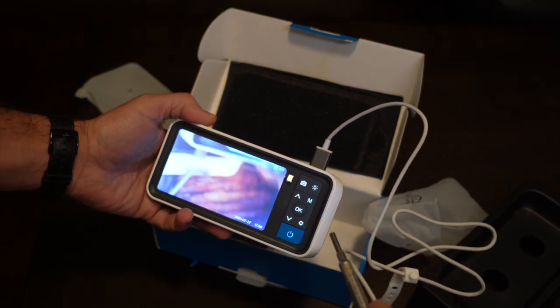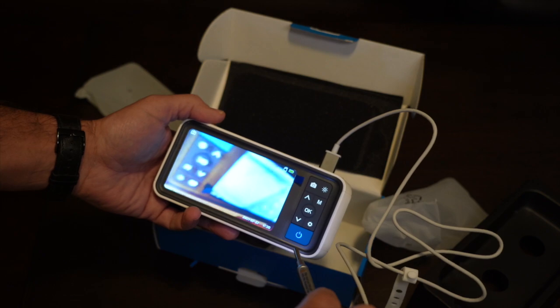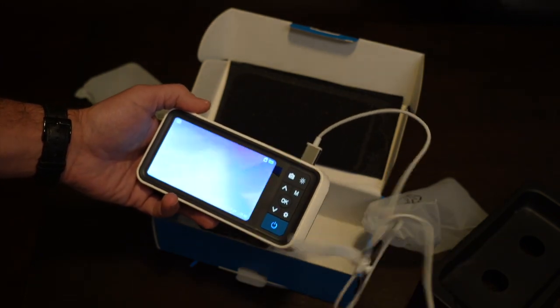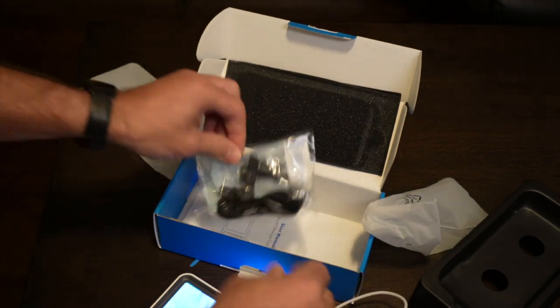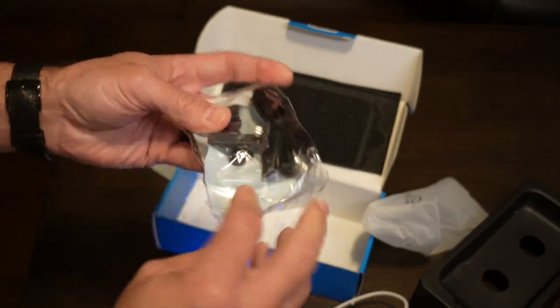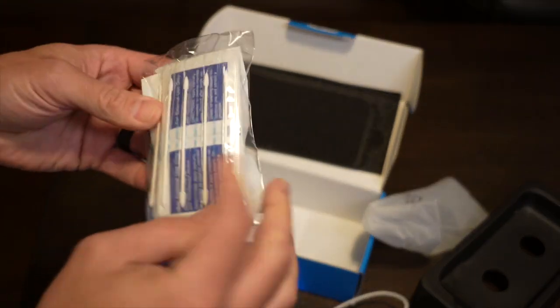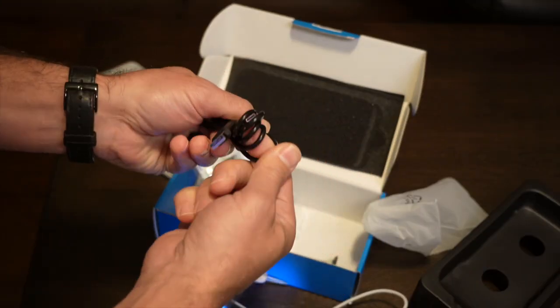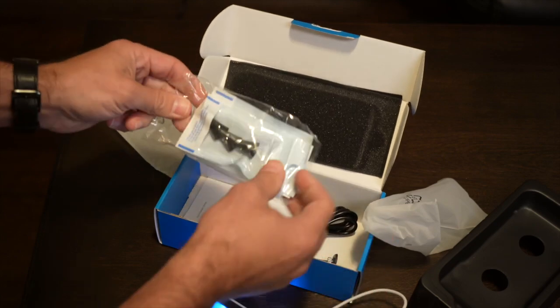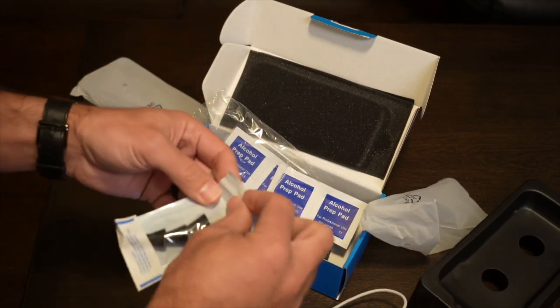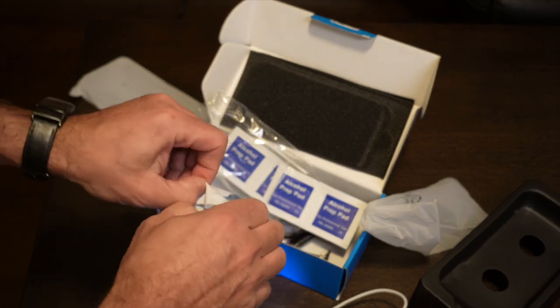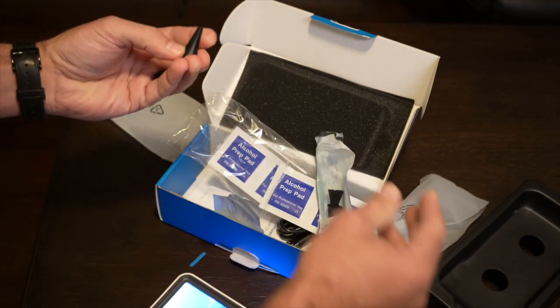Pretty good image. You'll see how good it is when I take a picture of the area I'm examining. So it's got the little kit in the bag, that's a soft kit, also if you want to perform medicine, it starts to have some alcohol wipes, some things to clean the device, and there's a USB-C cable. So here are the otoscope tips, I'm going to take one to try it out.